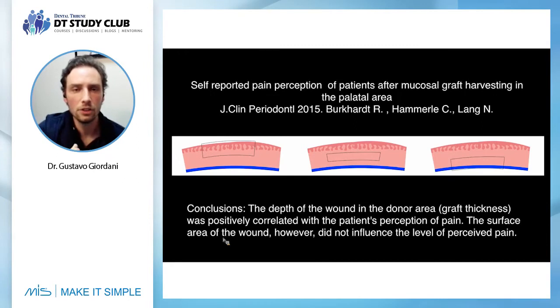very bad tissue quality, because as deep as you go, more glandular tissue and adipose tissue. And of course, when you go deep in the palate, you are closer to the artery. So my advice, use the technique to remove the superficial part of the palate. You're gonna have better tissue quality, comfort for your patient, and also you will avoid more and more problems with cutting the artery, which will be safe for you in your procedures.